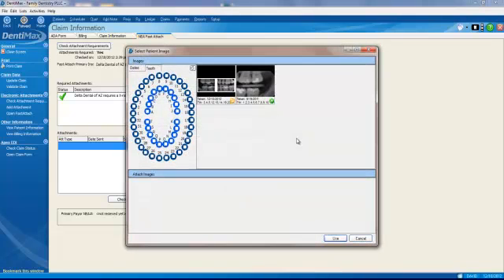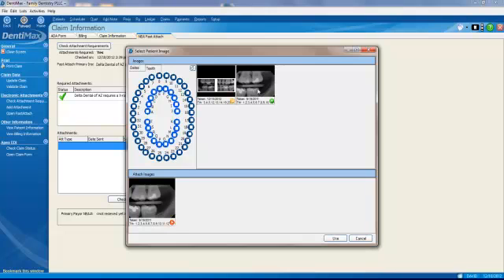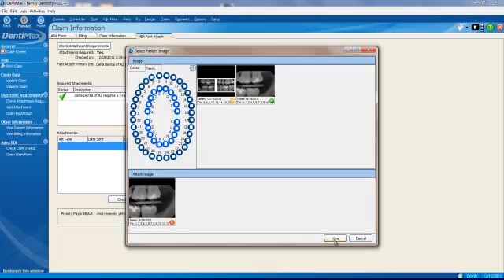And here they are. We can, if you want, just click on the attachment we want to do. Maybe just double click it. It puts it right there. We'll click on Use.